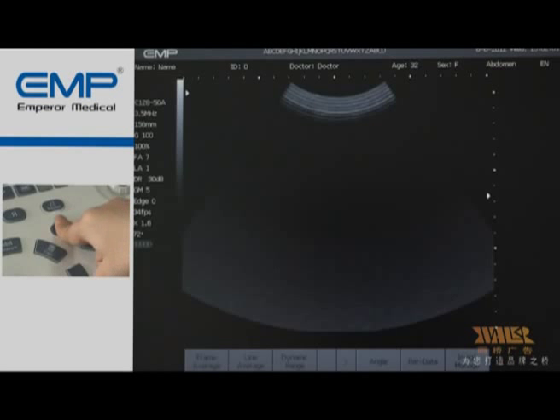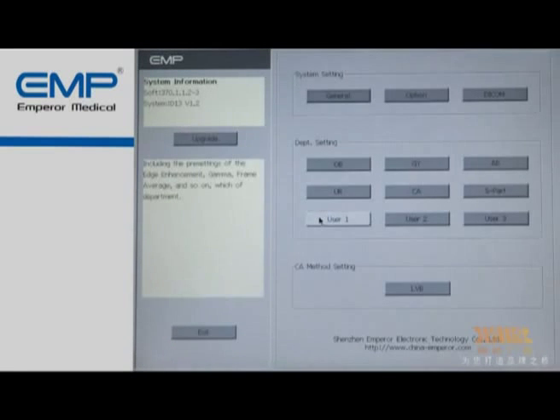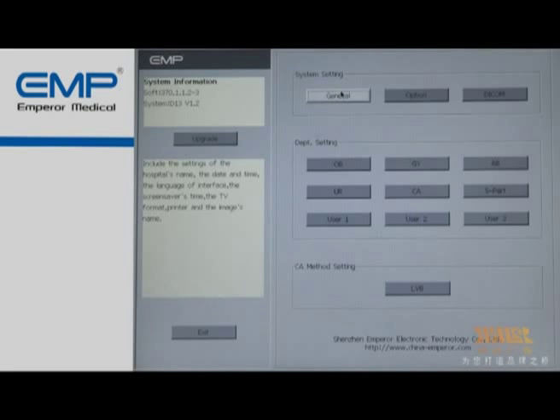When the system test is over, it will enter B mode. Before scanning, first press the preset button to set some regular parameters. Enter the presetting interface, and items will be displayed on the screen, including system settings, department preset, measuring method setting, and system upgrade. Move the cursor location by rolling the trackball in the dialog box. Click the Exit button or press the ESC key to exit the presetting interface.